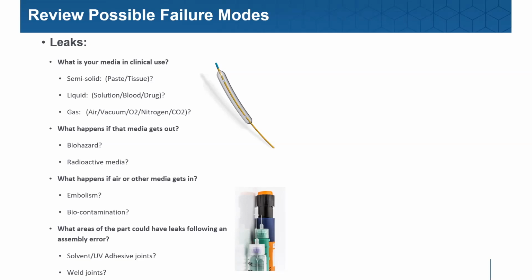The other thing that happens is the trach tube could be indwelling in the patient for up to 3 weeks. And what happens if the trach tube begins to leak and the balloon starts shrinking? Potentially, the patient could drown in their own saliva for a period of time. So those applications are a tragedy to try to test with anything but a tracer gas.